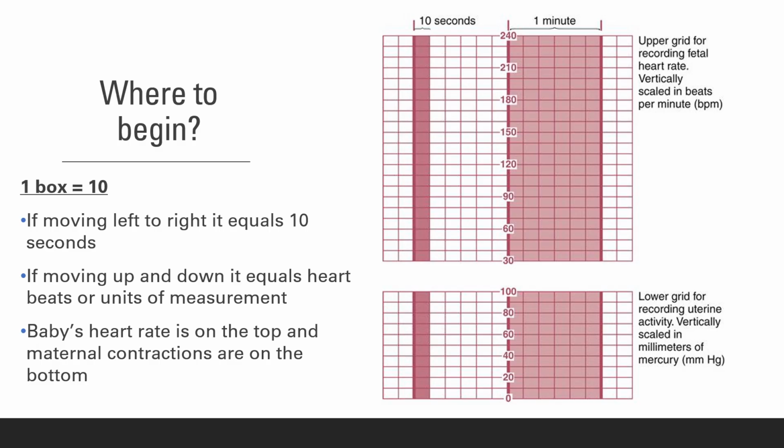All right, so when it comes to fetal tracing, we use a piece of paper to record the actual tracing. In labor and delivery, depending on where you work, some nurses record the tracing on a piece of paper, but the majority of facilities now have central fetal surveillance, where the fetal monitoring system is displayed in the room and on the units, on the walls.